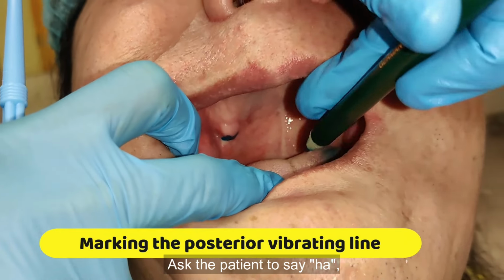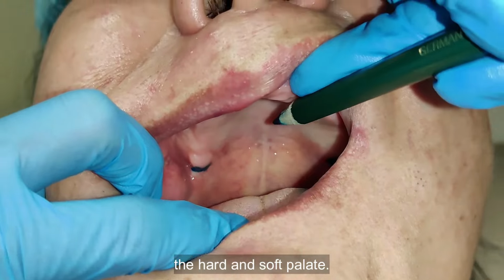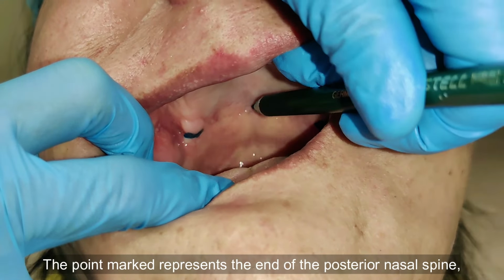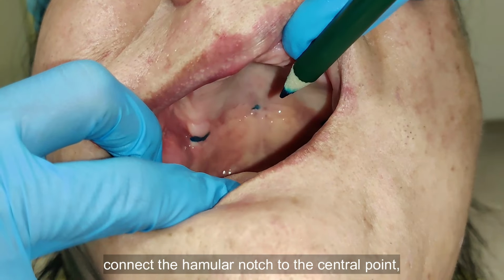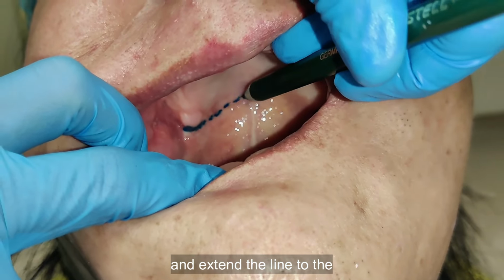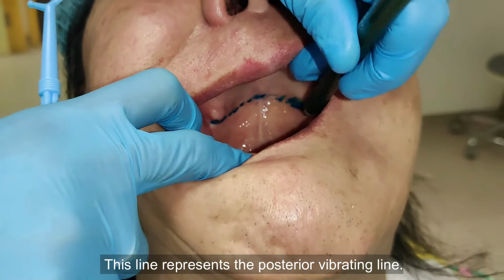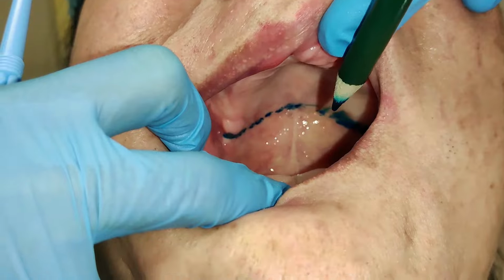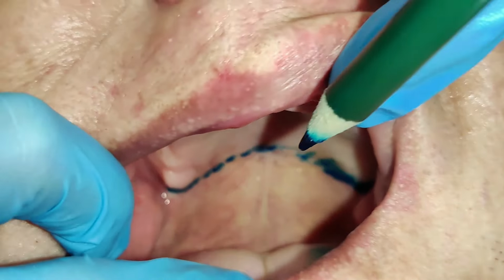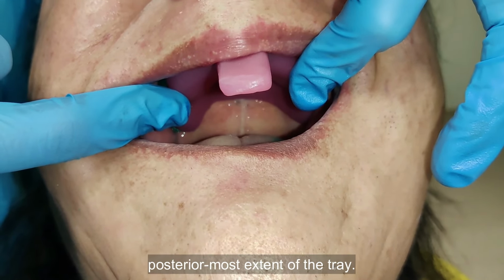Ask the patient to say "ha" so that you will be able to demarcate the junction of the hard and soft palate. The point marked represents the end of the posterior nasal spine. Connect the hamular notch to the central point and extend the line to the opposite side hamular notch. This line represents the posterior vibrating line. Place the special tray so that you can check the posteriormost extent of the tray.